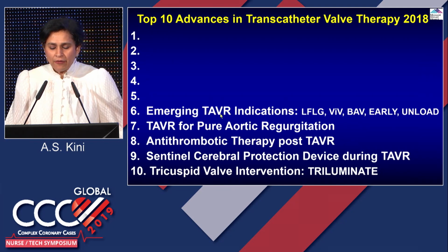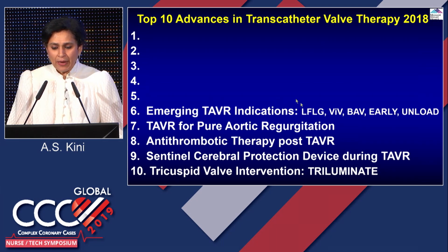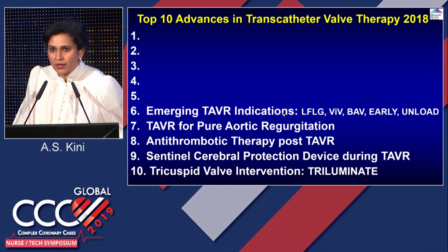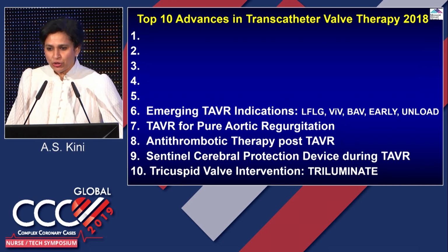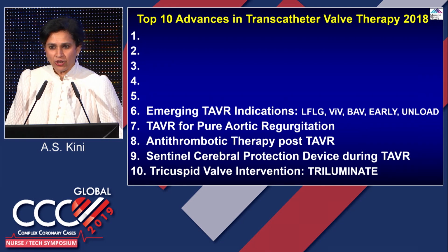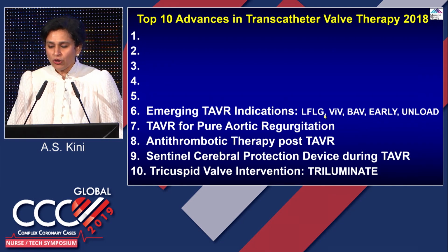Now, TAVR, we know, I'll go over some of the indications at this time: who should be getting TAVR, and what are the emerging indications? And that is one great thing about interventional cardiologists. Once we hit the target, we are not happy with that, we have another new target. So we are like, okay, we hit aortic stenosis, we are not done. Let's see what else we can go for. So what are the newer things? Low flow, low gradient, then valve-in-valve. And what we are talking about is early.